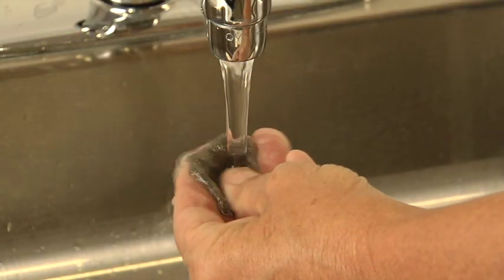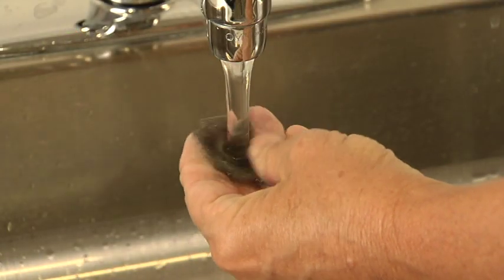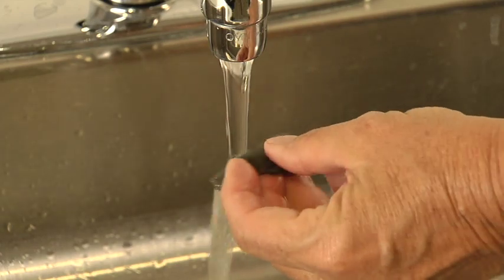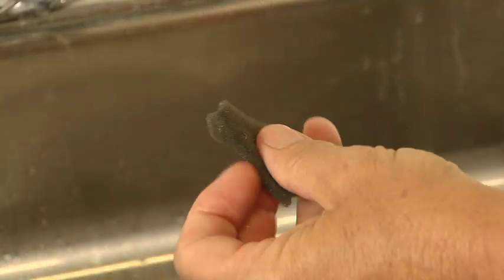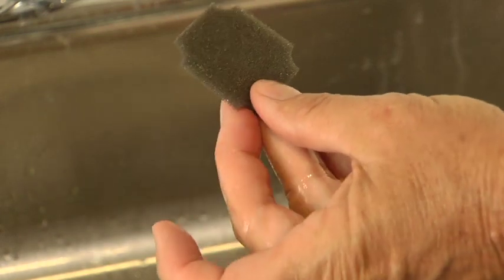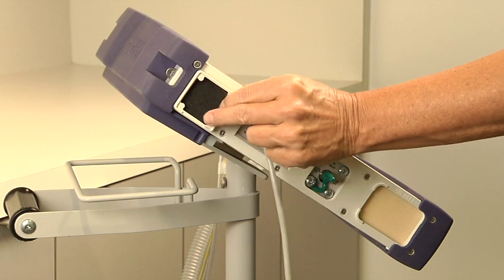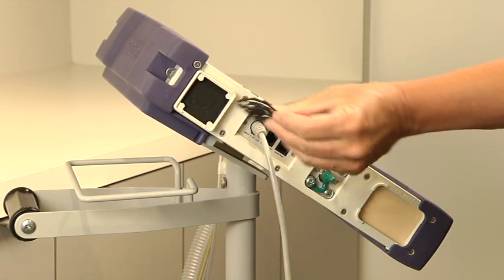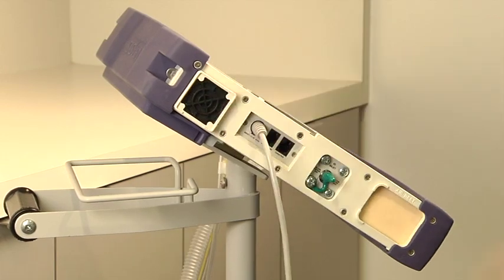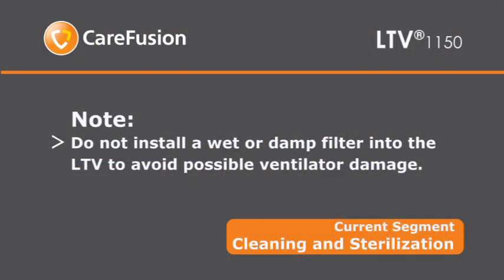Hand wash the filter using warm water and a mild liquid detergent. Rinse the filter thoroughly in warm water to remove all detergent. Inspect the filter for damage and replace if necessary. Allow the filter to air dry before reinstalling it. Reinstall the filter and snap the fan filter grill into place. Do not install a wet or damp filter into the ventilator. This could damage the ventilator.